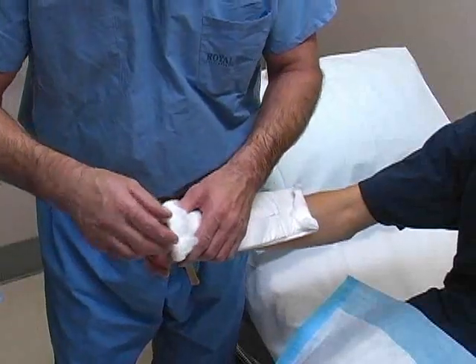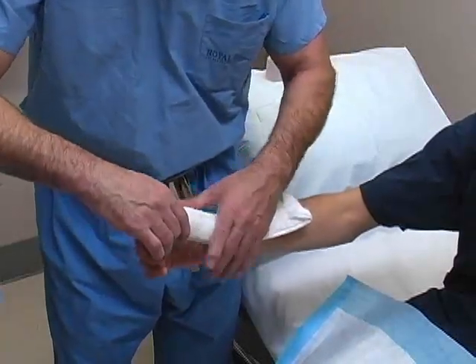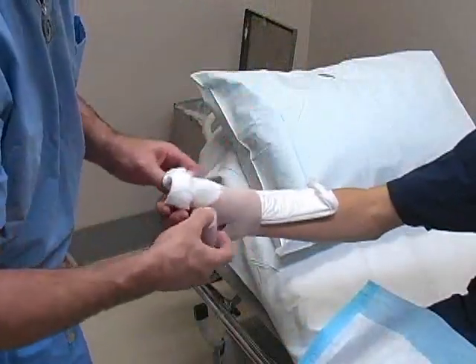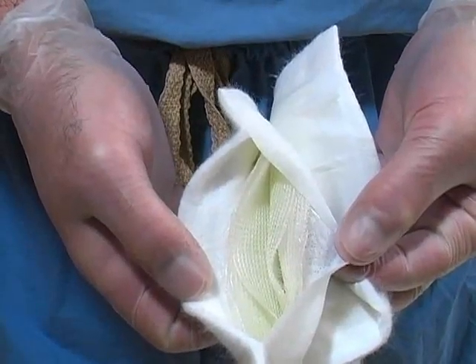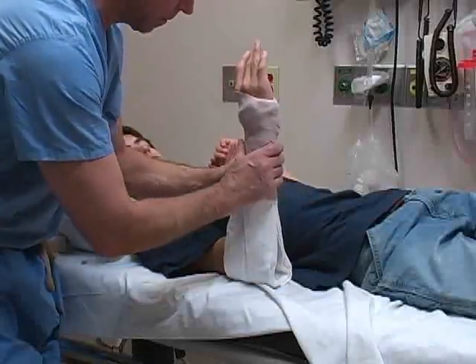There are many different types of splints, which are used to stabilize fractures and other traumatic injuries. In this video, we will demonstrate the general technique used in the application of both plaster and prefabricated fiberglass splints. Specific techniques for various anatomical regions are covered in separate chapters.